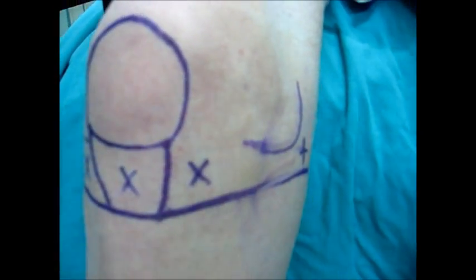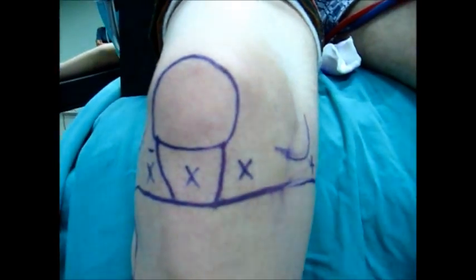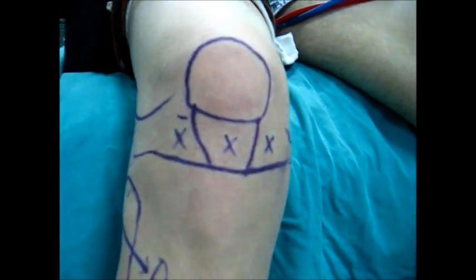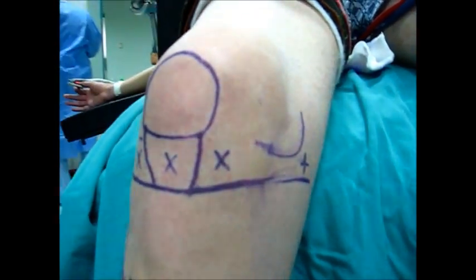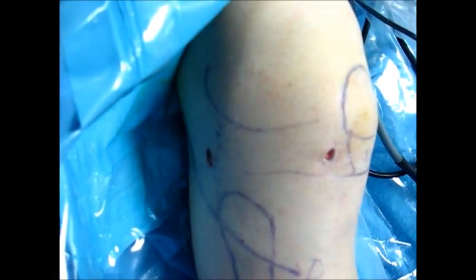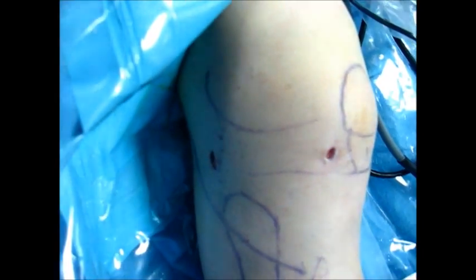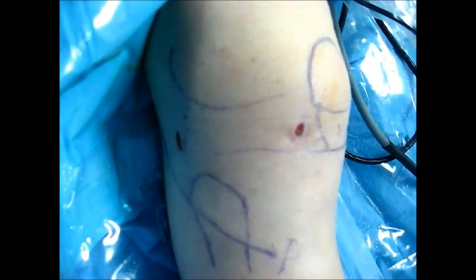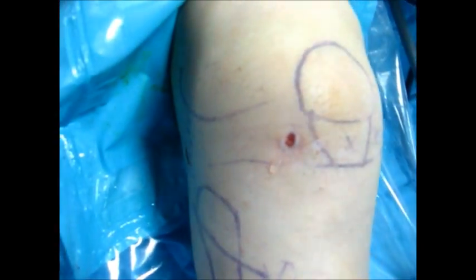This patient has pigmented villonodular synovitis. We will go through the arthroscopic debridement of all the synovium. These are the anatomical portals which we made during the total arthroscopic debridement of the synovium due to pigmented villonodular synovitis. You can see the portals we used in this operation.